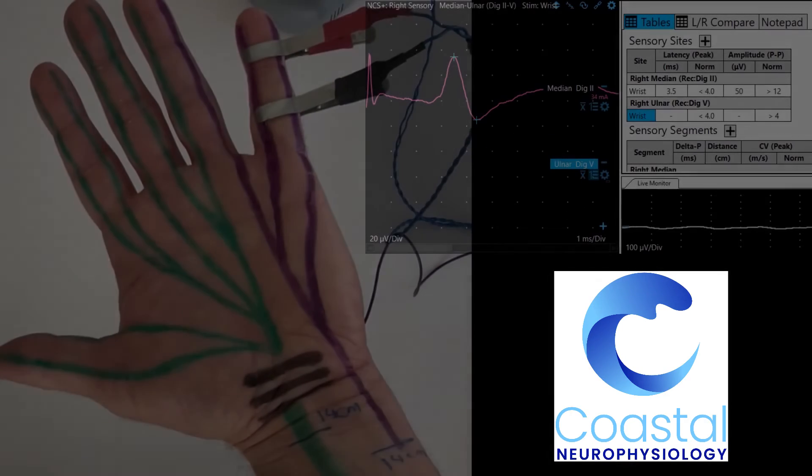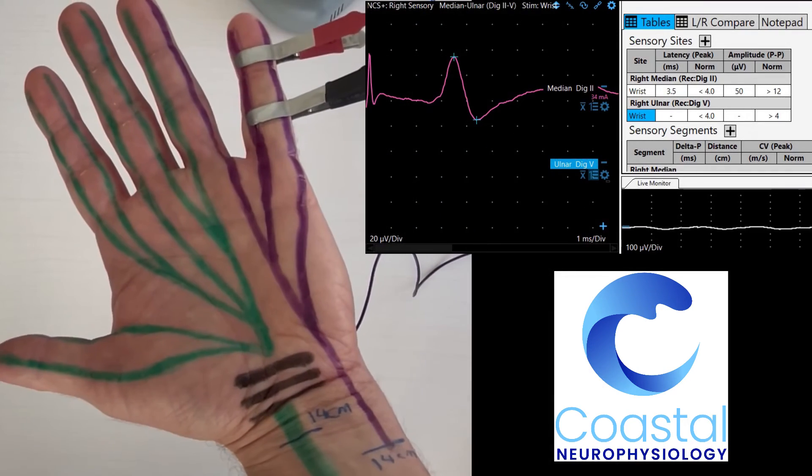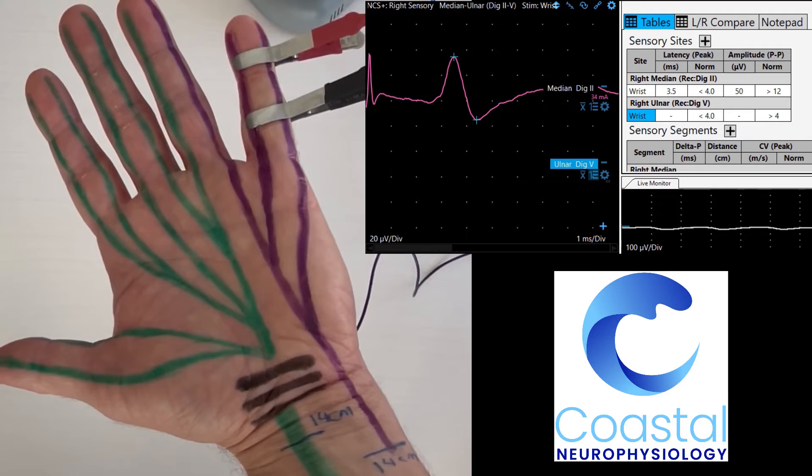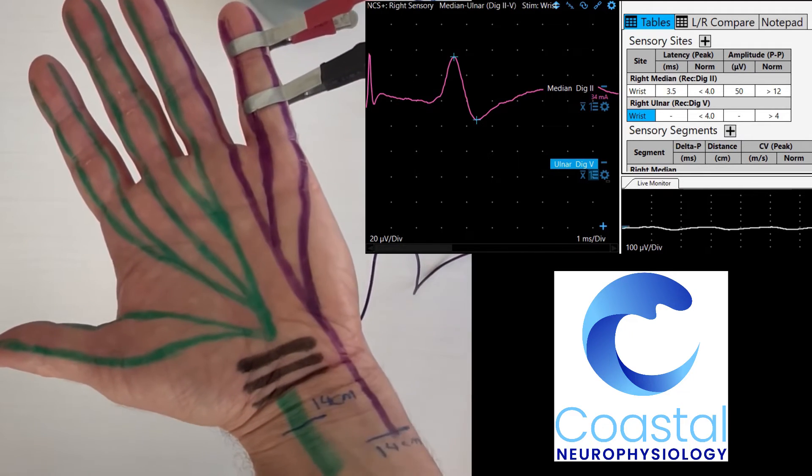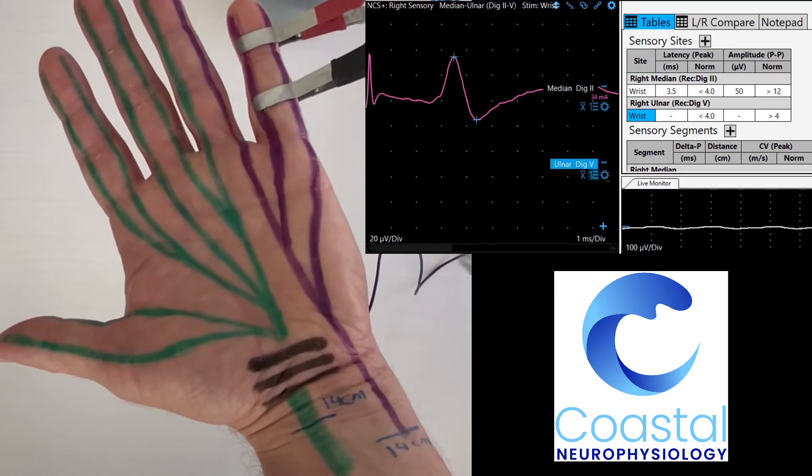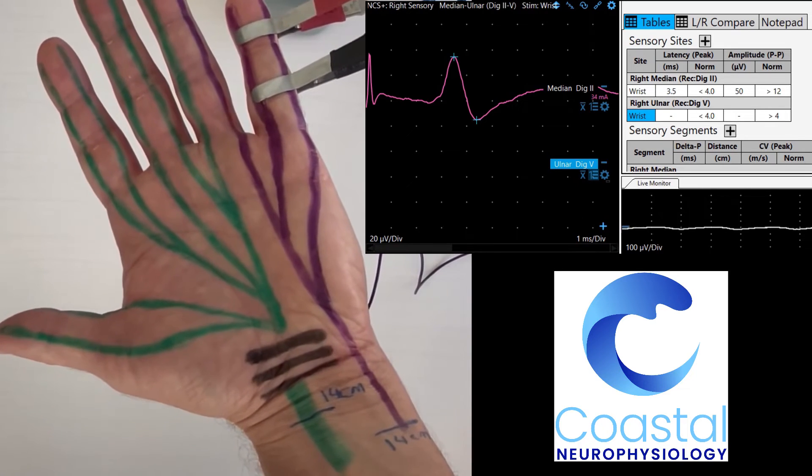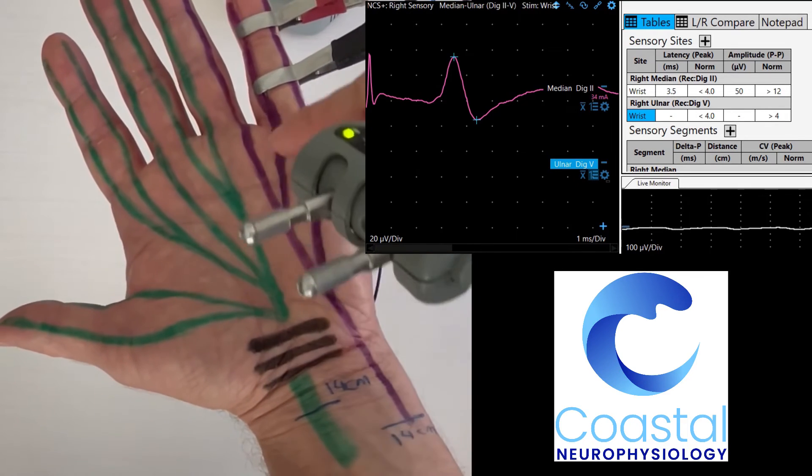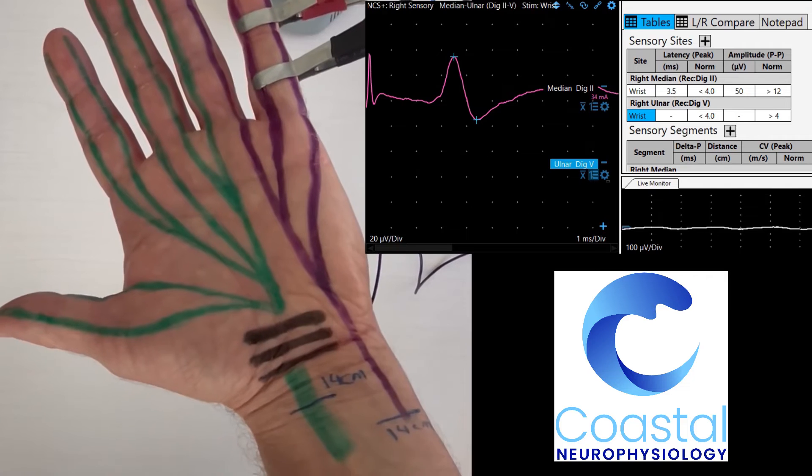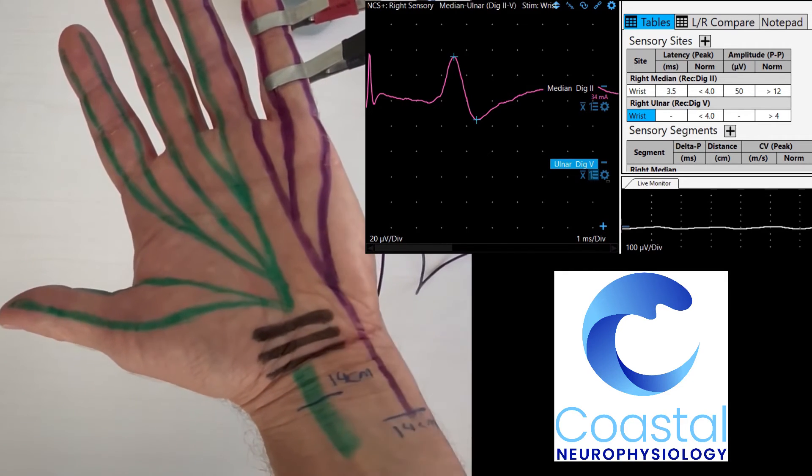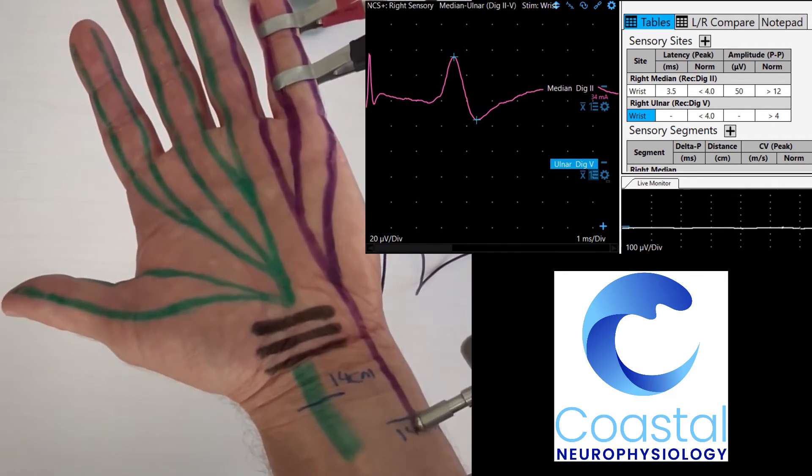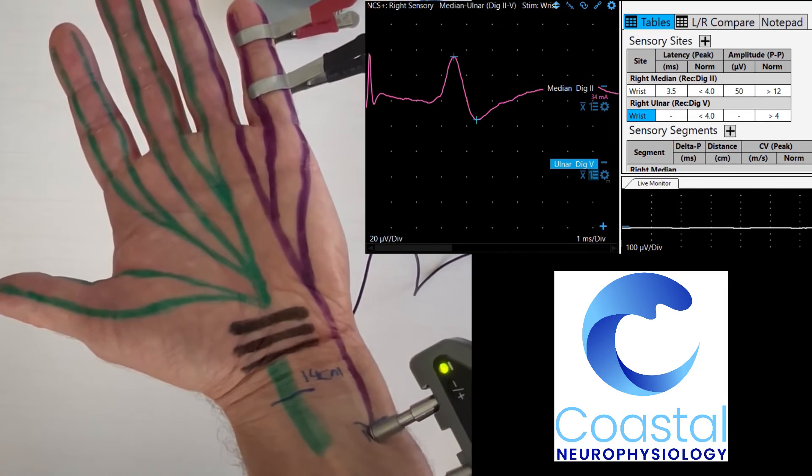An identical study can be performed but instead sampling from the ulnar sensory nerve instead of the median. If we stimulate the ulnar nerve at the wrist, sending the signal up the nerve fibers to the electrodes that are now placed on the fifth finger. The ulnar nerve bypasses the carpal tunnel, so if there was a problem affecting the median at the carpal tunnel it does not affect the ulnar nerve. This allows us to then compare the two nerve fibers to each other.